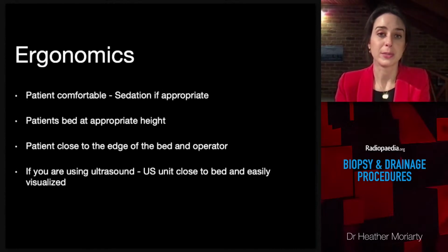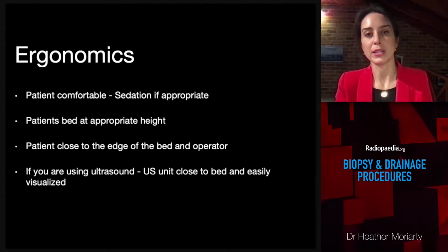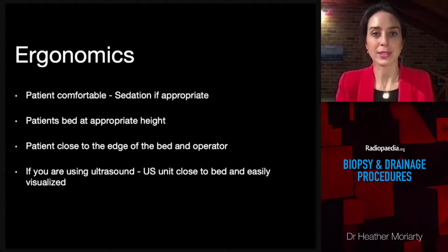Obviously, it's important to make sure your patient is comfortable. And it sounds banal to say it, but it's really important to make sure you're comfortable too. Try not to overstretch to reach your needle, have the lesion close to the operator, the patient close to the edge of the bed. These small things can help a lot if it's a lengthy procedure.